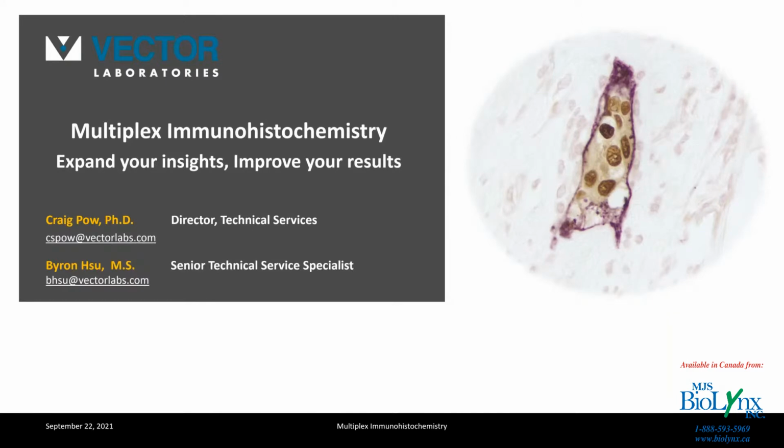On the right-hand side of this title slide, I have a great example of double labeling. This is a section of human breast carcinoma stained for a lymphatic endothelial cell marker, highlighted here in the purple. The other marker is estrogen receptor, which is highlighted by the brown staining in these particular cells here.